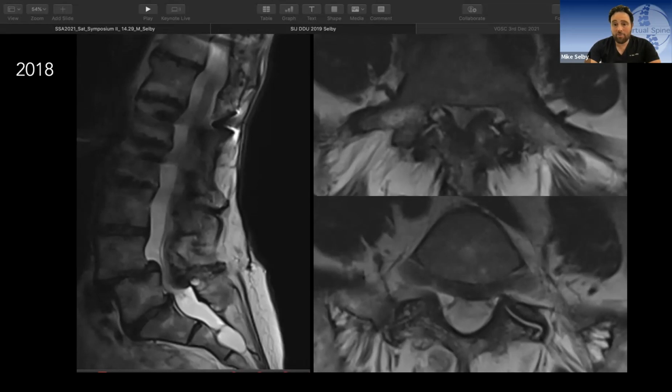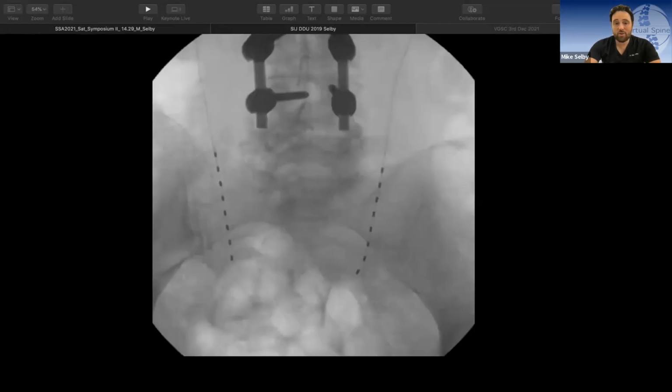Anyway, again, I think the patient and perhaps the primary surgeon were a little resistant to suggesting further options. And so off she went to a pain physician and got this, which was probably never going to help. It was a $20,000 battery and 2 wires for peripheral neuromodulation.